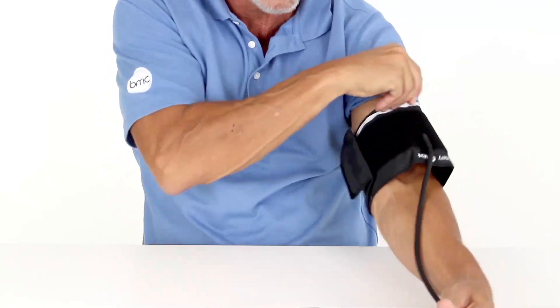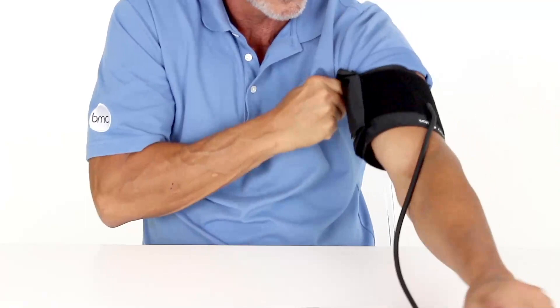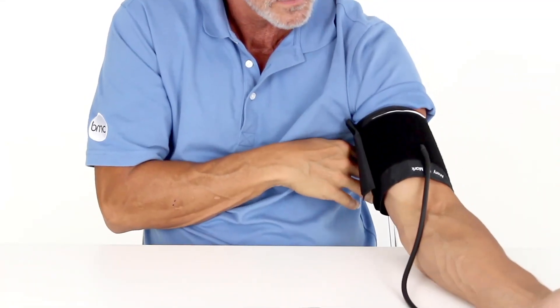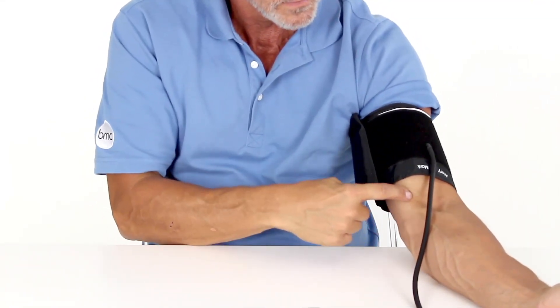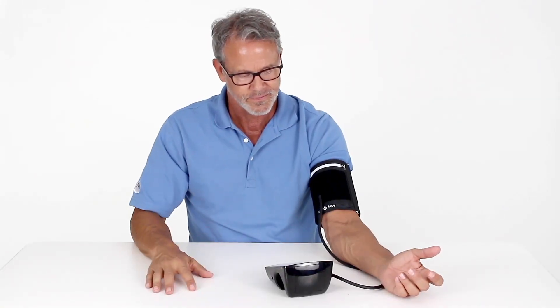Put on the cuff at heart level on your bicep. For reference, this is a few inches above your elbow. Ensure that the cuff is tight on your arm with room for about two fingers of space between your arm and the cuff.